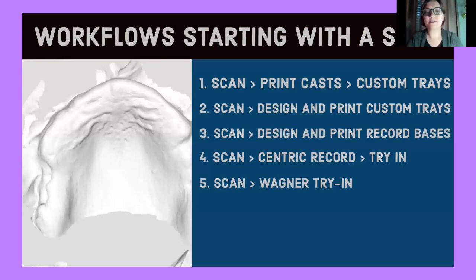If you choose to start with a scan, there's a lot of ways you can go to your next step. So the most clunky, analog to digital back and forth is to scan, print the casts, and make conventional custom trays. Usually what I will do when I start with an intraoral scan is I'll scan the soft tissue, and then I'll jump into a software where I can design and print either custom trays or record bases, depending on the case. And then I can jump right into a wax rim workflow.